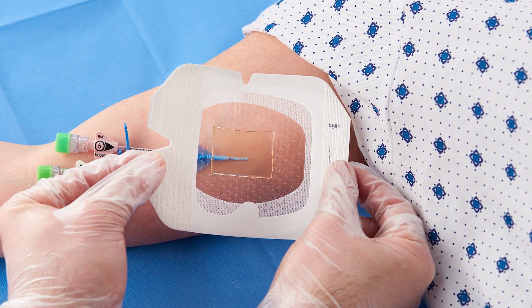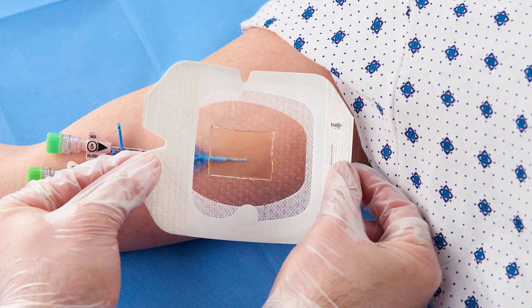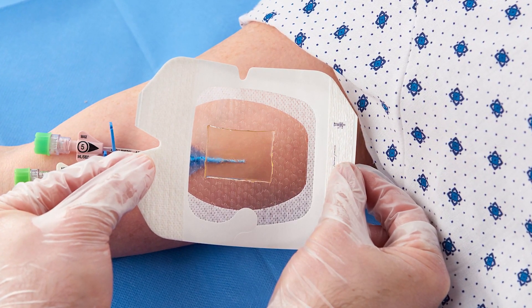Using aseptic technique, open the Tegaderm CHG package and remove the dressing. Peel the liner from the dressing, exposing the adhesive surface. Flip over the dressing so the adhesive faces the skin.